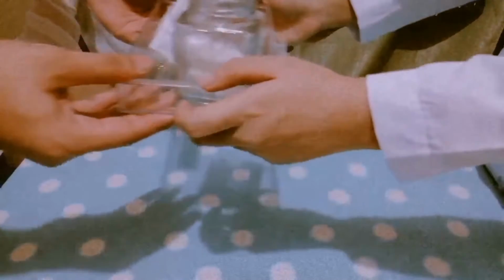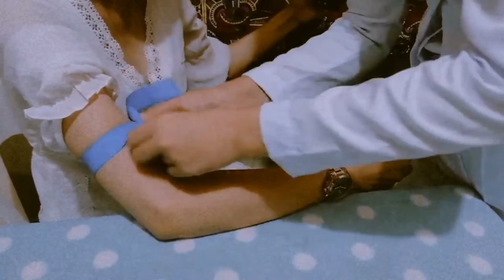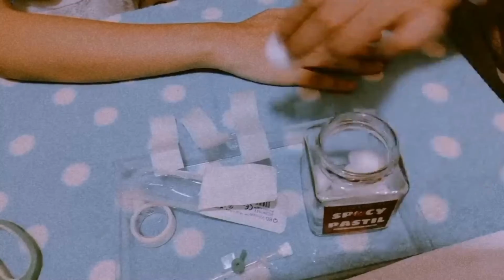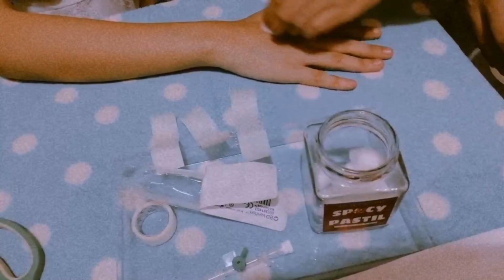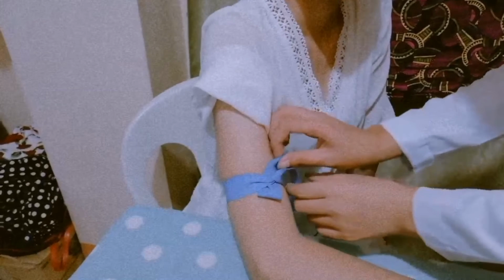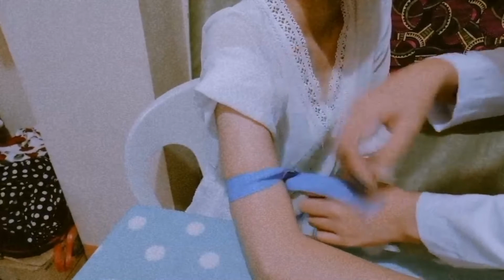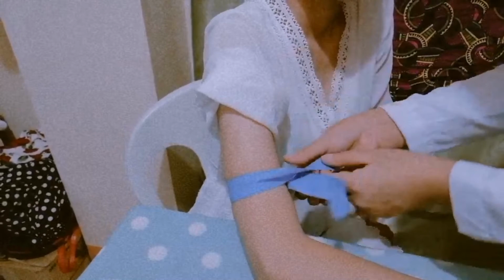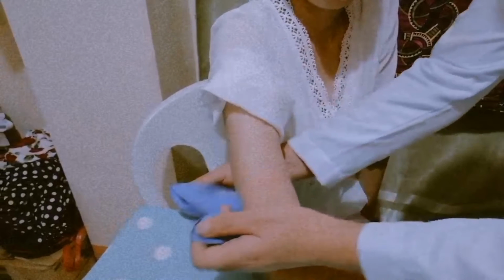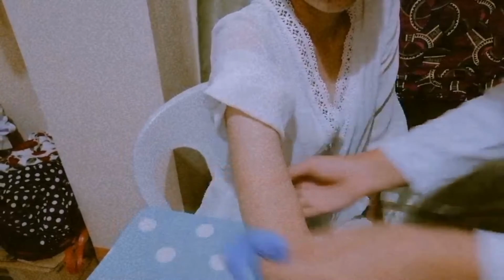Hand the tourniquet to the doctor or nurse followed by cotton balls with alcohol and needle or vasocan. Observe while the doctor or nurse is inserting. Anticipating the needs of the doctor is one good characteristic of a nurse. Release the tourniquet when he or she indicates or when a return flow of blood to the adapter is observed. The tourniquet causes increased venous pressure resulting in automatic backflow, an indication that the needle is inserted into the vein.